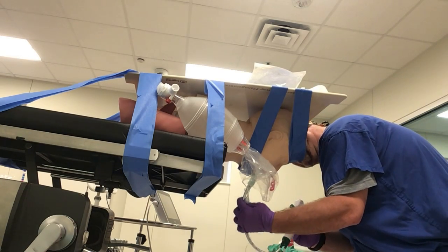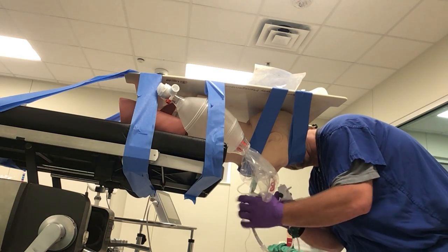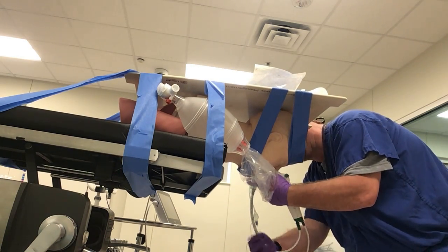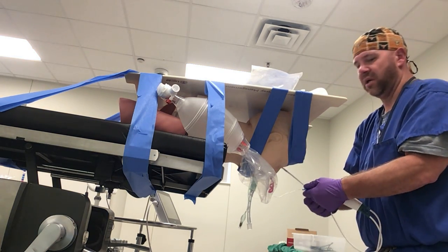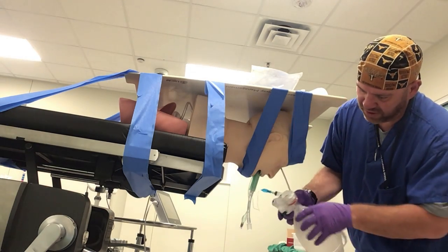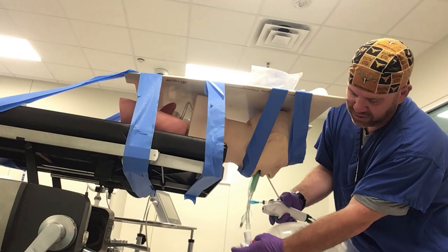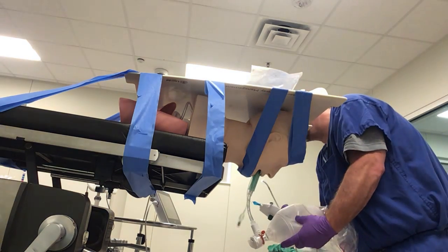One thing to be cautious of is to make sure that you do have the appropriate size endotracheal tube to fit through your LMA. An extra set of hands is also always beneficial as you're trying to pass the scopes out. And again, I may go ahead and ventilate my patient. Pretty fast process, and as I mentioned, it's a little bit easier because you don't necessarily have to have the patient in an easily accessible position.